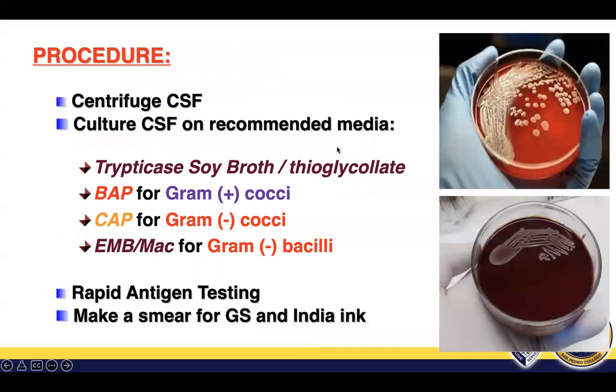Okay, so the procedure for cultivation is as follows. Initially we centrifuge the CSF and then we work with the sediment. We culture the sediments on the following culture media: TSB or trypticase soy broth, or thioglycolate.